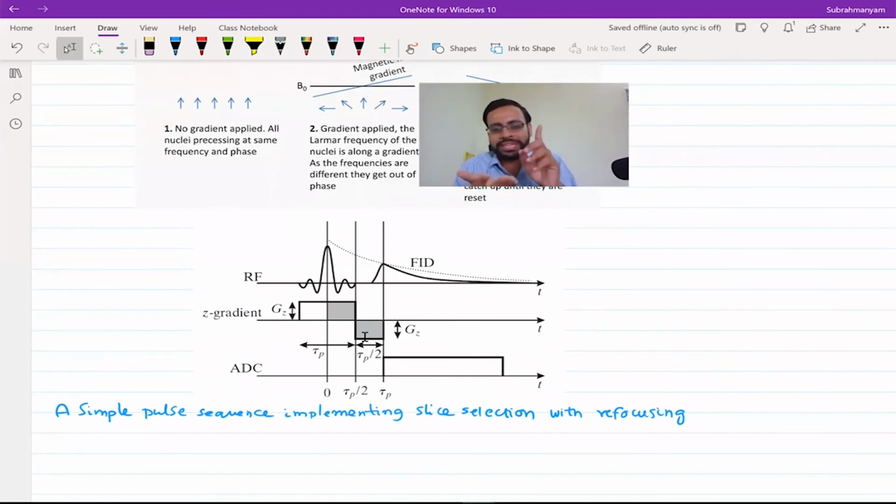So I hope at least this point is clear: the moment the thickness is high, with the varying z value within it, you are getting a response from all the spins within this thickness in the z direction. Each one is rotating at its own speed, so each one is at a different phase now, because each is rotating at a slightly different speed. In the XY direction, you would get a zero signal. Is that clear? Can you visualize that part?